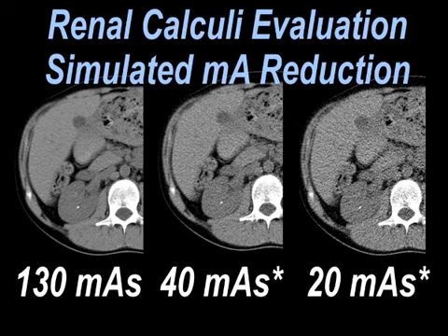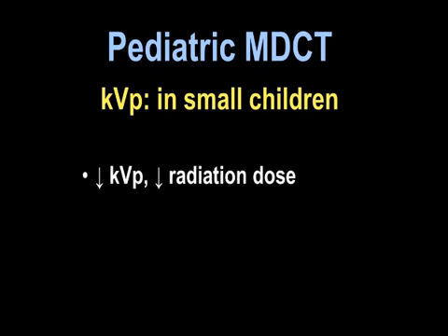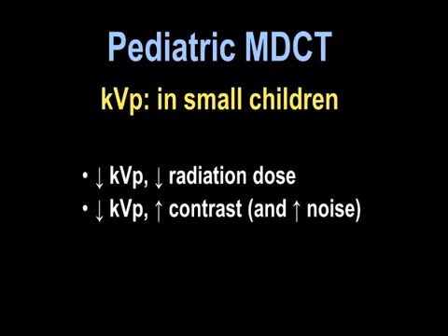So as you're seeing, there are certain applications for which dose modification can be made in pediatrics as well as adults. So let's look at kVp a minute, and you've had some elegant introductions to what kVp does here. I will just summarize that because we have small cross-sectional areas, and oftentimes, especially with CT angiographic evaluation, we have high contrast things we're looking at, we can use a lower kVp. So it decreases the radiation dose.